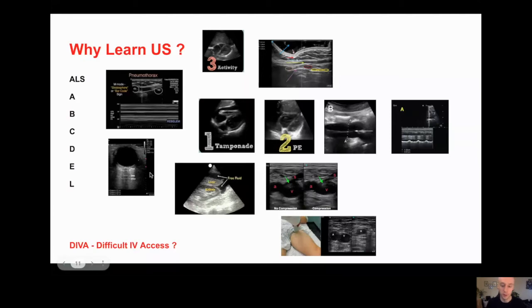And there are different levels of ultrasound training that you can do and get official accreditation. So just because you've put an ultrasound probe on and you can't see a thrombus or a non-compressible vein doesn't mean they don't have a DVT, but there's nothing stopping you from grabbing the ultrasound in that person with an obviously swollen unilateral leg, putting the probe on. Oh yeah, look, there's a massive clot in their proximal femoral.